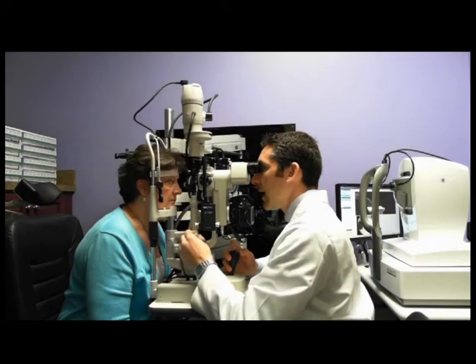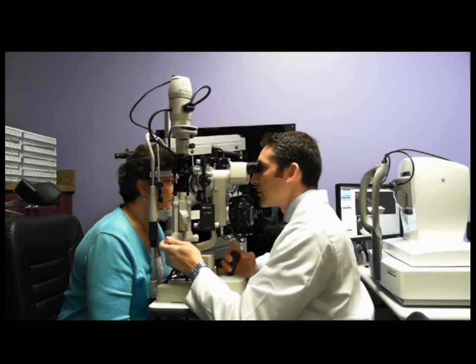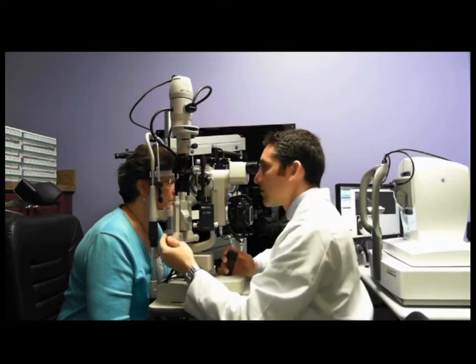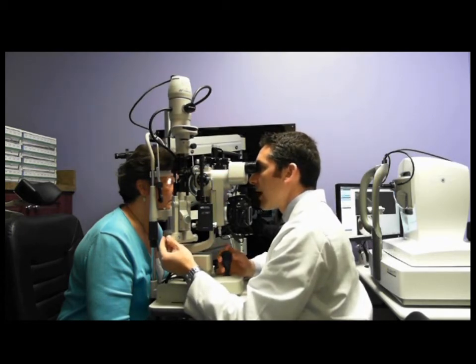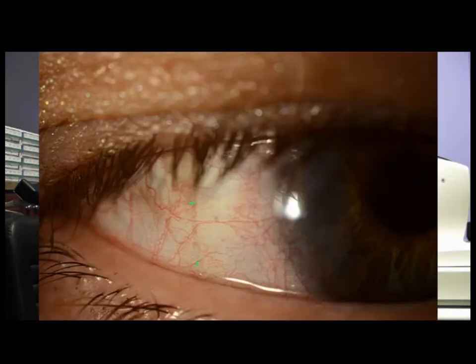So what we notice is, right off the bat, centrally, we have adequate vault. I'm going to look off to the side now, off to the periphery, and watch that vault as it goes all the way over to the limbus. That's pretty good. Now, the second thing that we are going to inspect is the alignment of the haptic on the sclera. Okay, so Darlene, I'm going to have you look slightly to the left. That's it. And let's make sure these images are coming out before we get too much further into this.